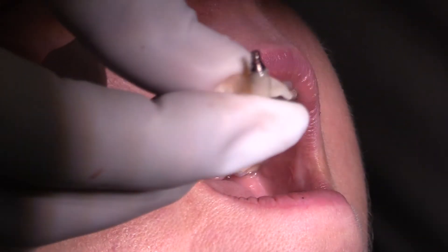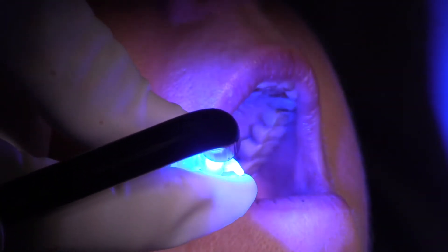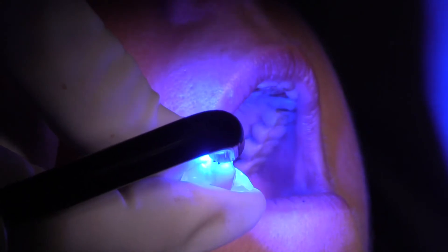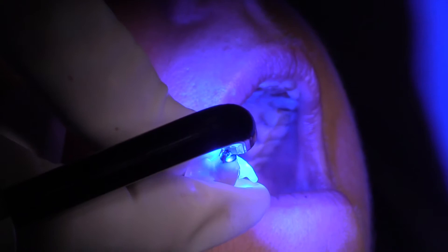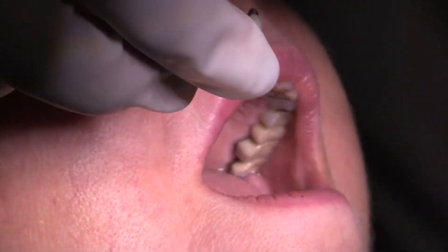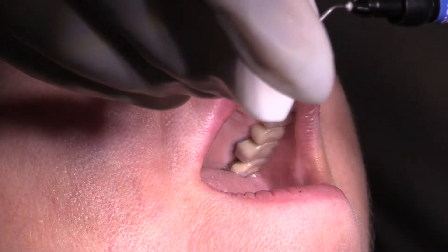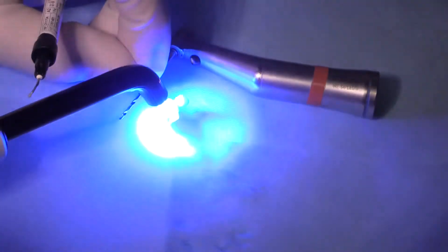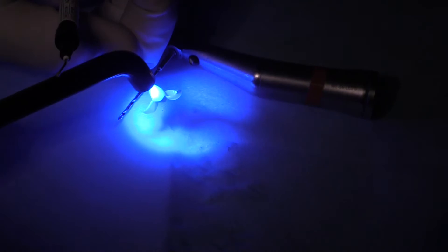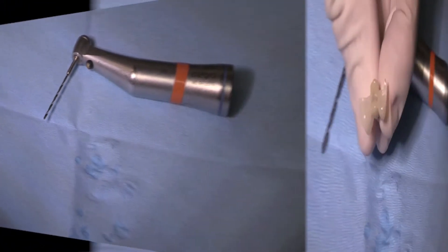We don't want to do this procedure in the mouth because it would get down around the top of the implant, and it's bloody up there — so we do this outside of the mouth. You might think: how do you get back into the temshell since the screw channel is no longer there? We filled the screw channel with a little bit of resin, but that's where this new drill comes into play — we can use this drill to drill into the temshell and through the access channel.